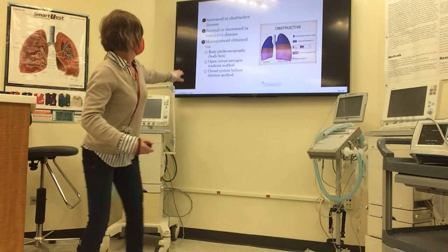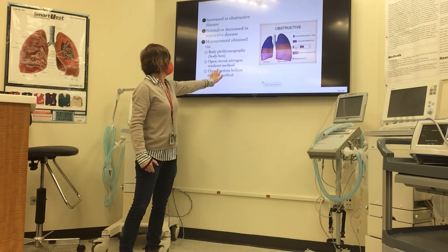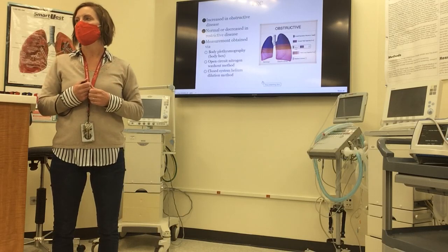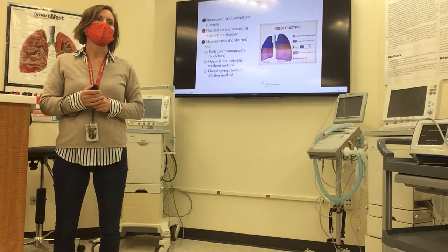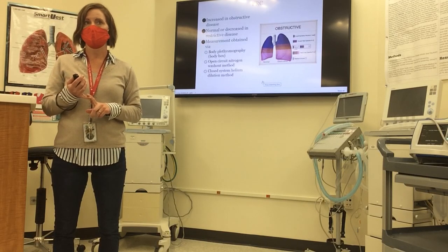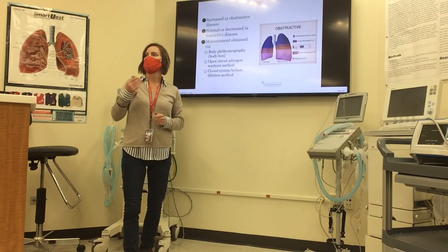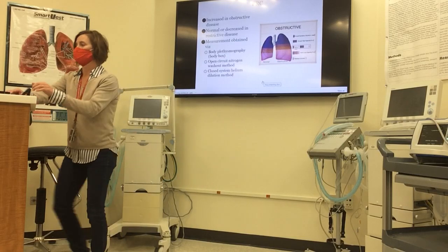Use something called an open circuit nitrogen washout method or a closed system helium dilution method. Those are for a pulmonary clinic or a department that doesn't have the ability to obtain a body box and maintain all that technology, but it does allow them to still measure that residual volume so you can get the functional residual capacity and the total lung capacity. These two methods are not as accurate as a body box, but they do still give a pretty good predictor of what it will be.